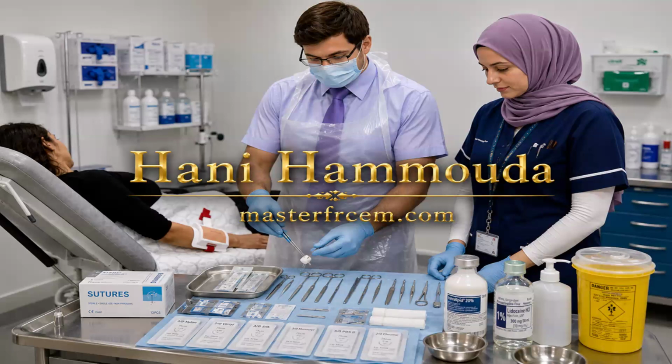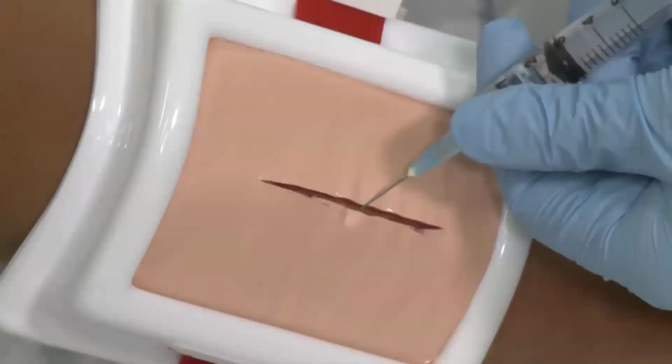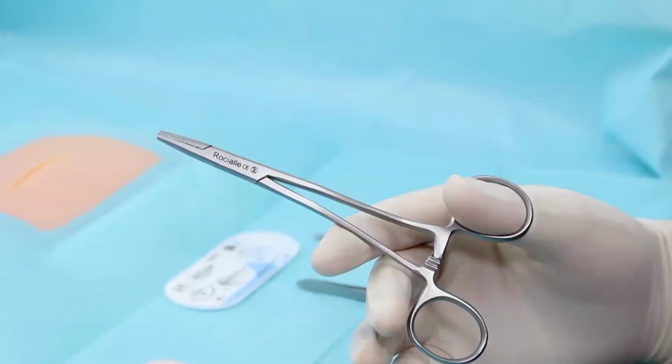Okay, is that okay? So the injection is given. We'll wait 5 minutes, and then we'll check the sensation. 5 minutes passed. I'll check the sensation. Can you feel it? No. Thank you. So now we will do the suture. I will use the suture material. I have got needle holder, needle, and suture material.